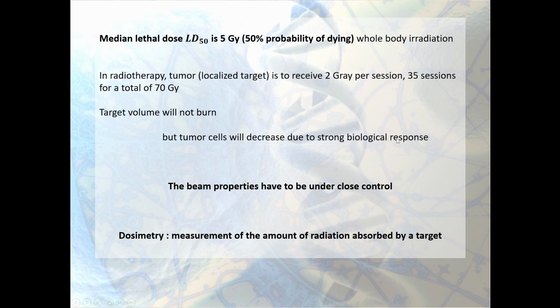And you have to be very careful because you are playing with very tiny amounts of energy and you will trigger a very strong response on the biological side. So the beam properties have to be under very close control. And dosimetry is the art of the measurement of the amount of radiation which is absorbed by a target.